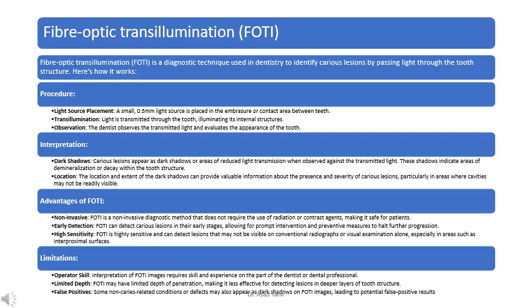Advantages of FOTI. Non-invasive. FOTI is a non-invasive diagnostic method that does not require the use of radiation or contrast agents, making it safe for patients. Early detection. FOTI can detect carious lesions in their early stages, allowing for prompt intervention and preventive measures to halt further progression. High sensitivity. FOTI is highly sensitive and can detect lesions that may not be visible on conventional radiographs or visual examination alone, especially in areas such as interproximal surfaces.